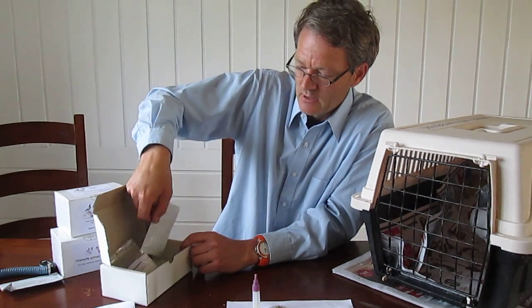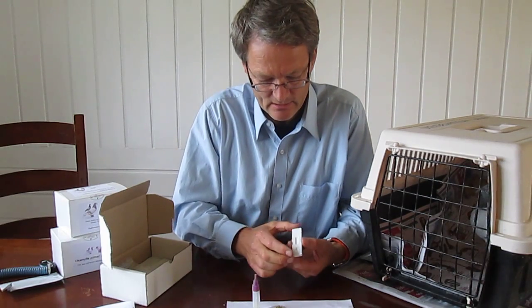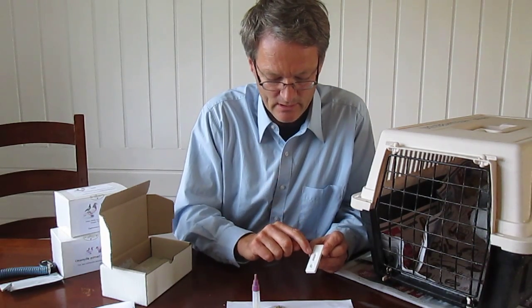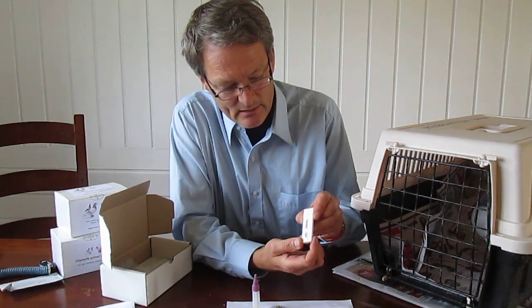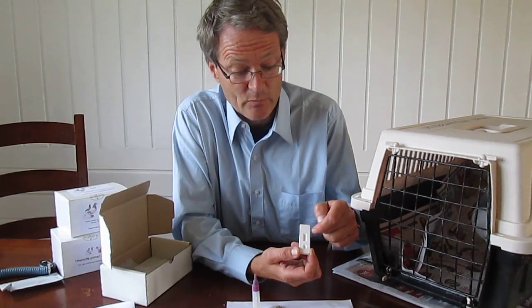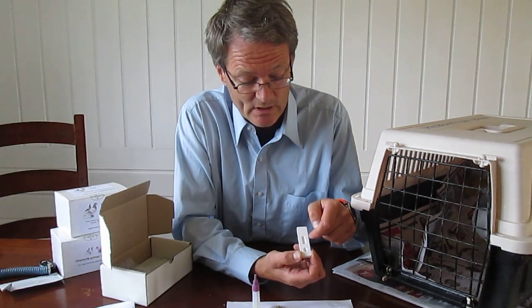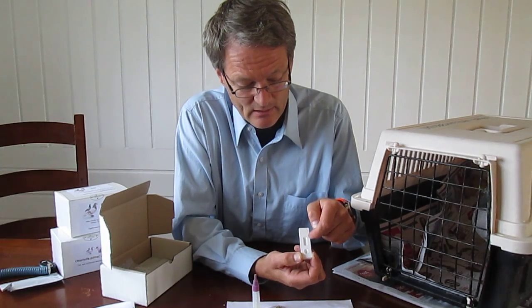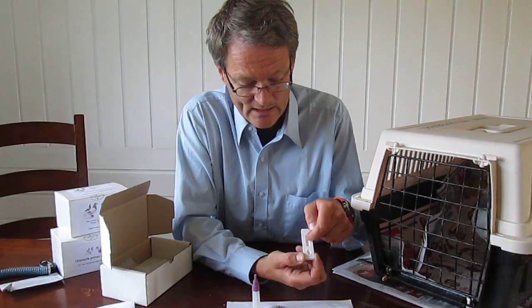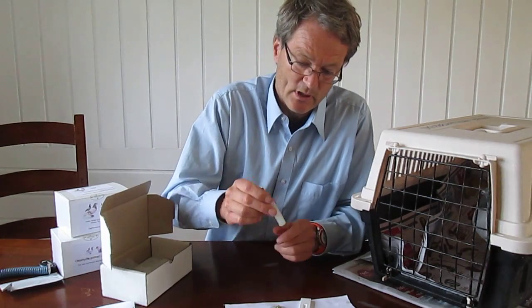Shake it so it all gets mixed. Then we have this small test strip, which consists of a round hole where we're going to put a bit of this liquid. There is a window with a tiny letter T — if the test is positive, meaning salmonella bacteria is present in the test material, we will get a stripe in the T area. If the test is functioning well, we will also get a stripe in the C area, where C stands for control.